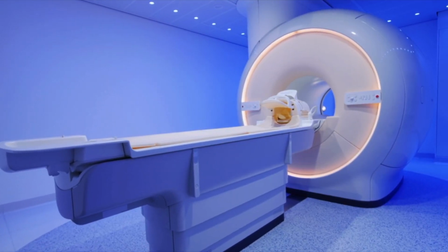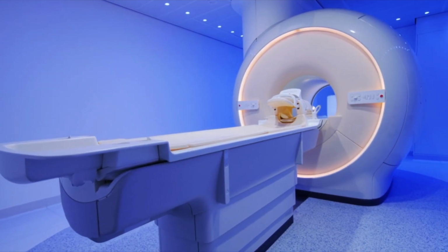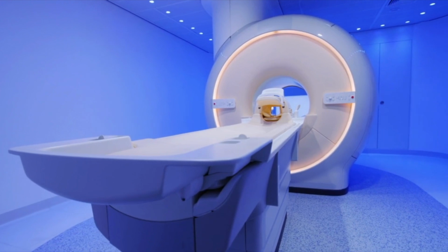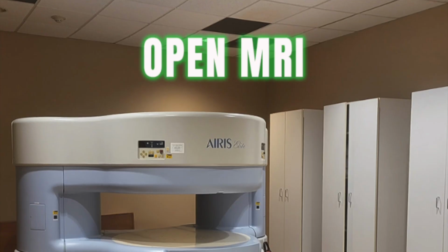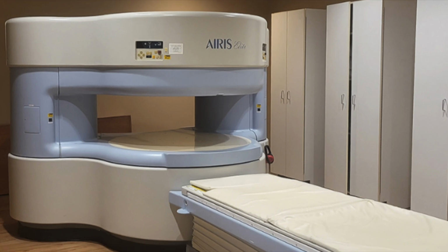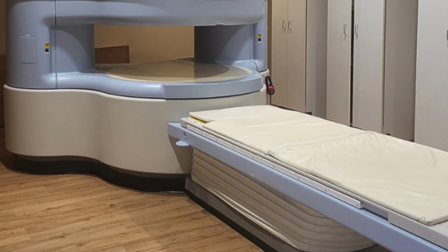So there's a closed MRI. This is the traditional MRI where the patient lies within a large tube-shaped magnet. This provides high quality images, but may cause discomfort for claustrophobic patients. And I can attest to this. I had so many MRIs growing up, and yeah. There is an open MRI, which has a larger open design, offering more space around the patient, thereby reducing those feelings of claustrophobia. However, it can have lower image quality than those closed systems.